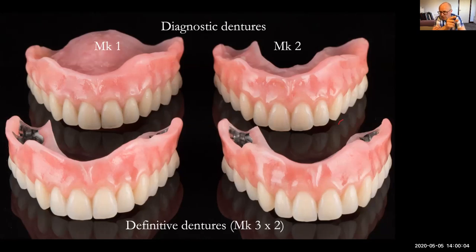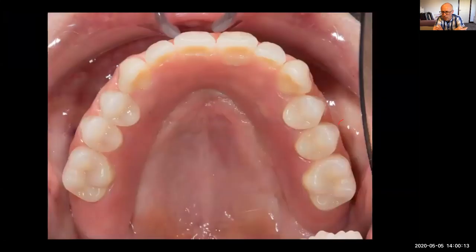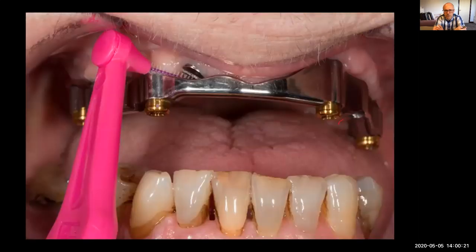And then it means that Rowan, my technician, is not under pressure to get it repaired and refurbished, because they flipping break these and wear them. That's it in place here with it finished there. And, you know, she can get under that bar and get it clean nicely. And she was really happy with that there.